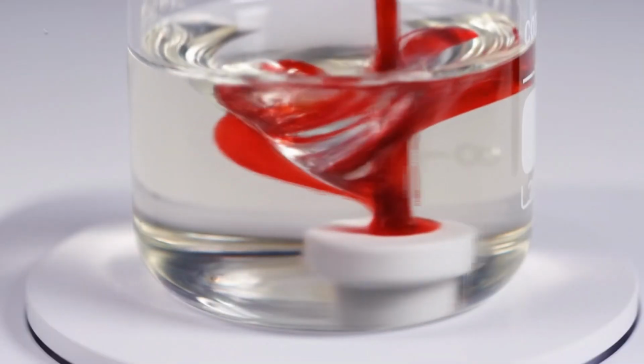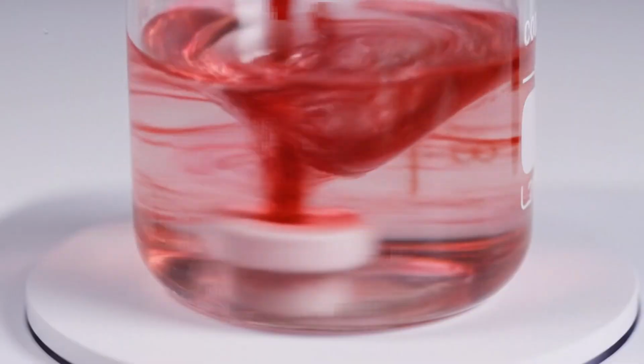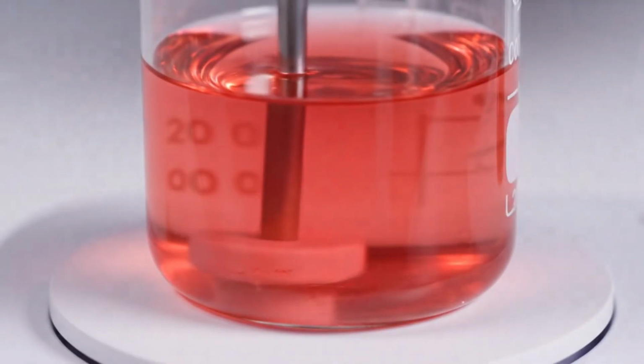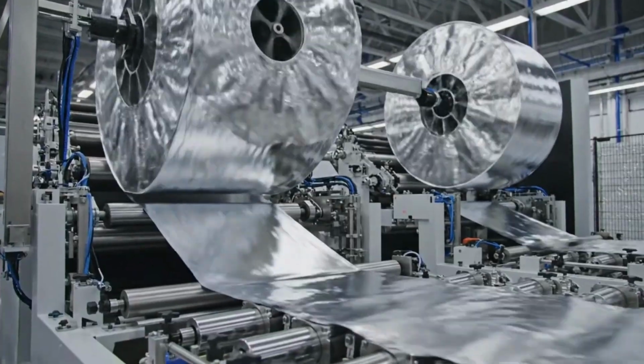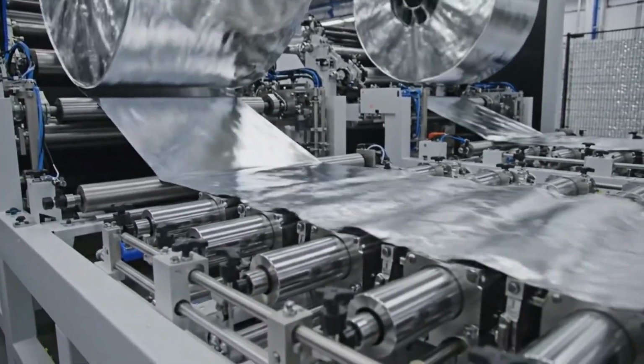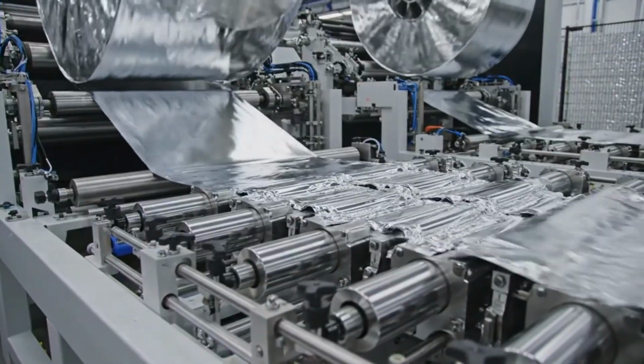Beyond safety, we add sensory appeal. All flavors are biocompatible and tested for safety. Our foil is a multi-layered barrier of aluminum and plastic, designed to block light, oxygen, and moisture.